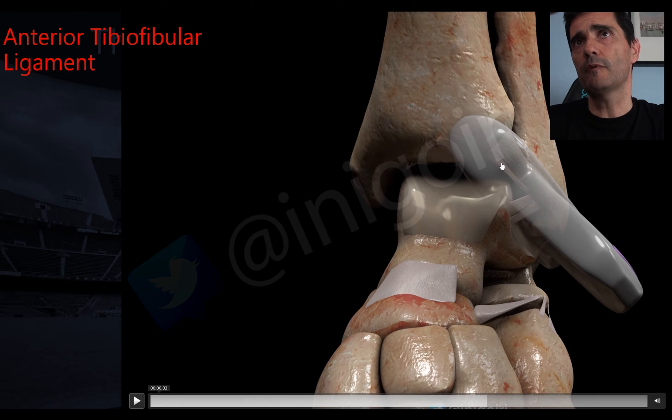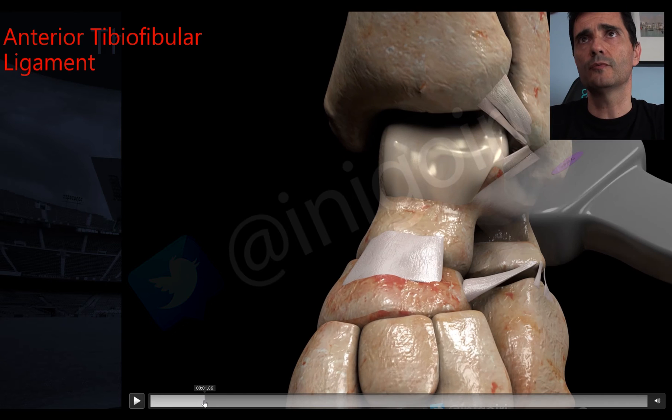When properly oriented, we should see this ligament. It has two components: an inferior and a superior one. This is very important because you must notice any affection of the inferior component.